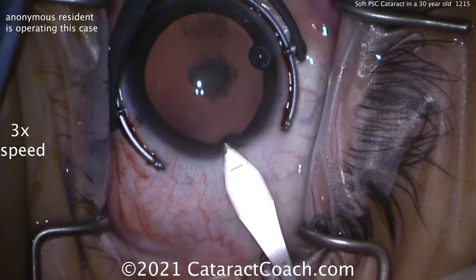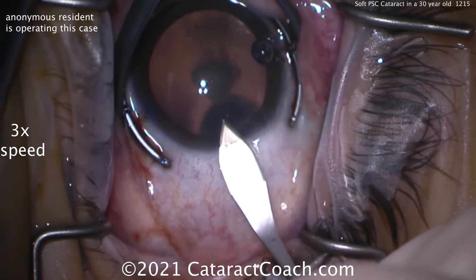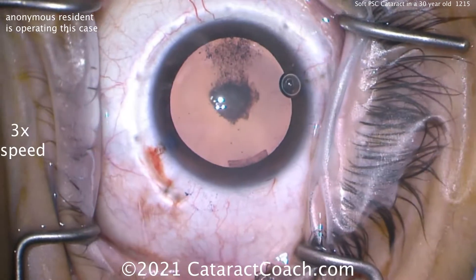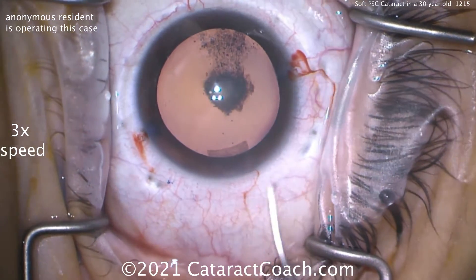Here comes the main incision — a nice, good tunnel length. Oh, I like it. It's a really nice incision. That's a beautiful job for this young patient. Great architecture. Look at that square incision. Very nice. Beautifully done.